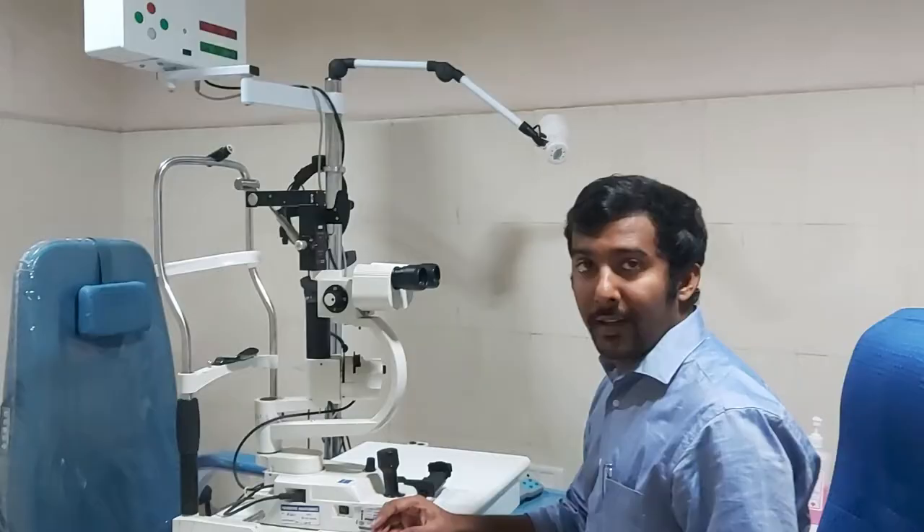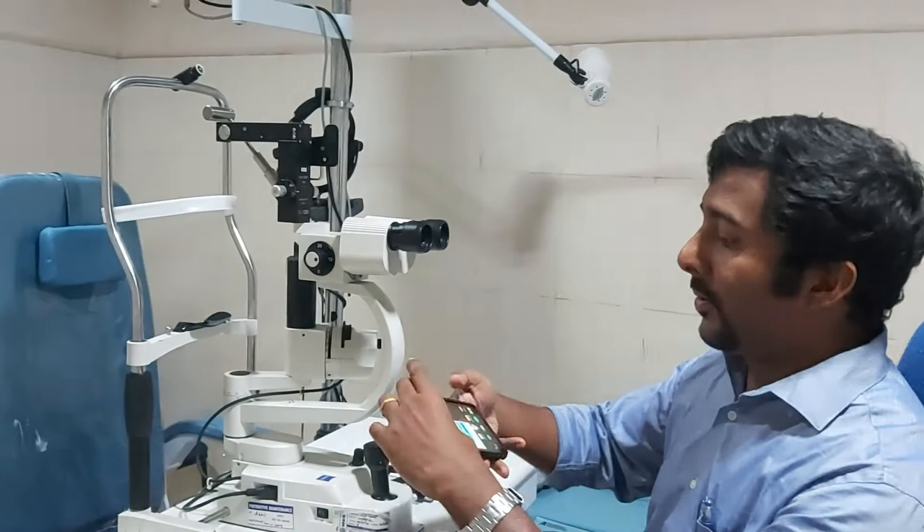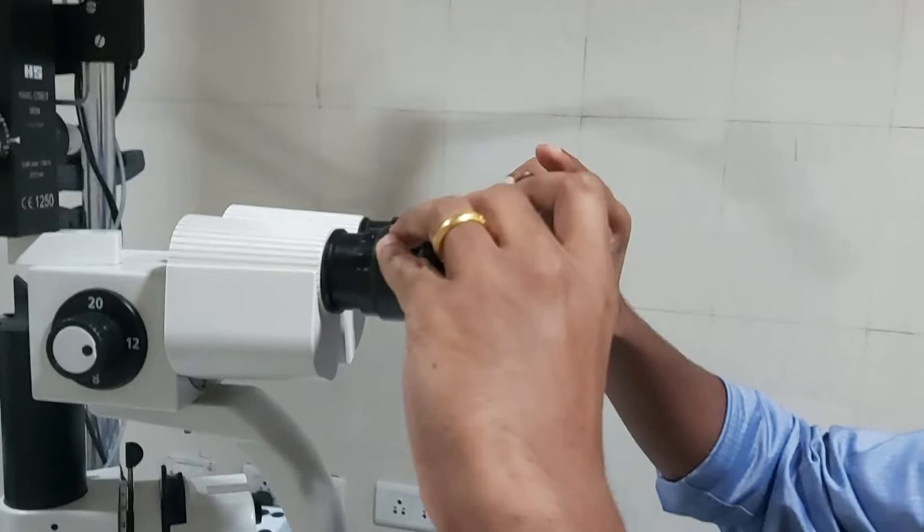I will teach you how to take slit lamp photographs with your smartphone. First, open the regular camera app and bring the phone to the eyepiece of the slit lamp, keeping it at a distance of two centimeters.